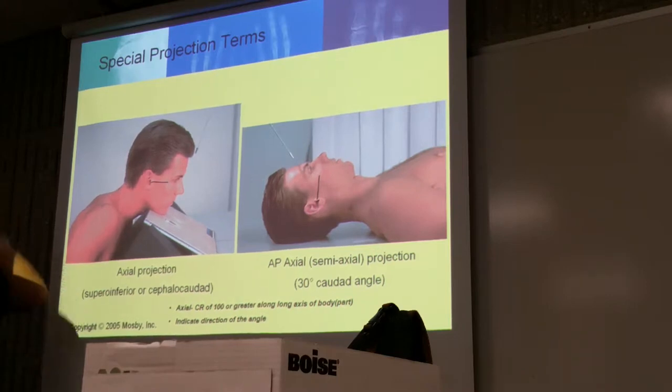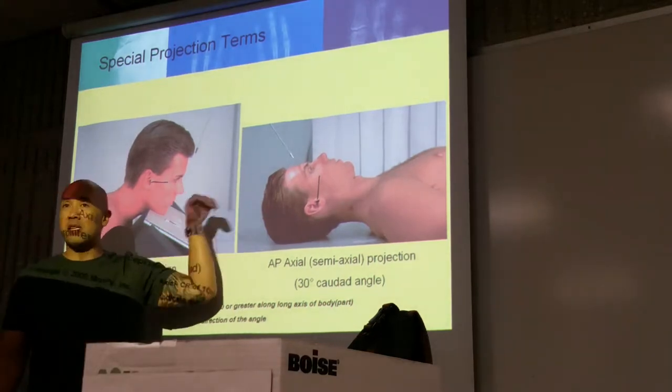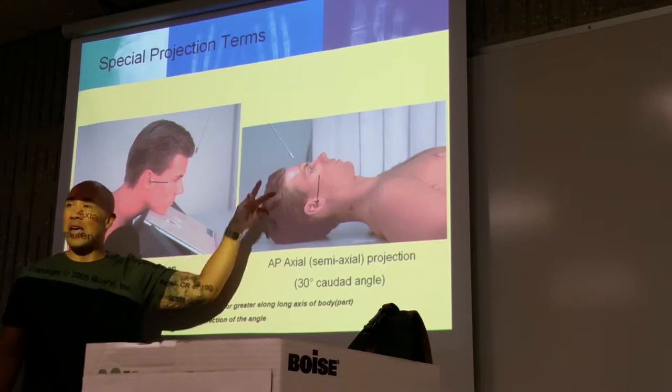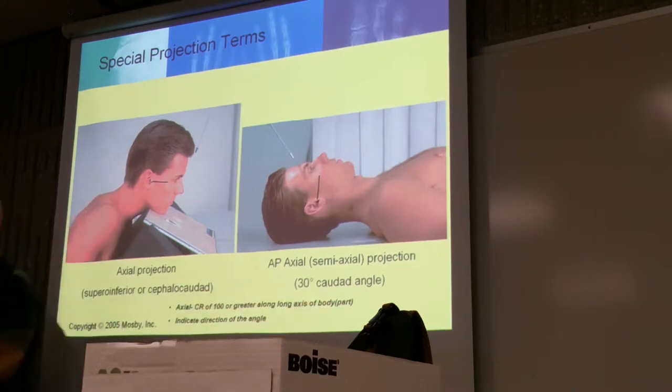If it's going towards the top, that's known as the cephalic or cephalad angle. Now, this is pointing towards the feet, so the angulation is caudal or caudad angle. So towards the head is cephalic or cephalad, and towards the feet is caudal or caudad.